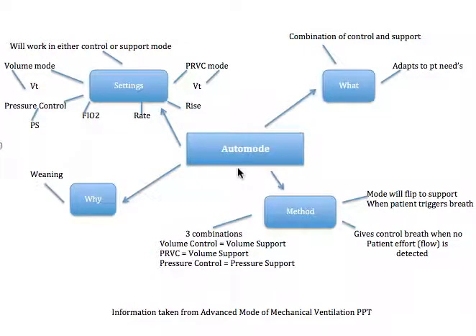Alright guys, we're going to go over the auto mode. So we've got the auto mode right here in the middle. Again, this information was taken from the advanced mode of mechanical ventilation PowerPoint. So when we're talking about our auto mode, let's talk about what this is.